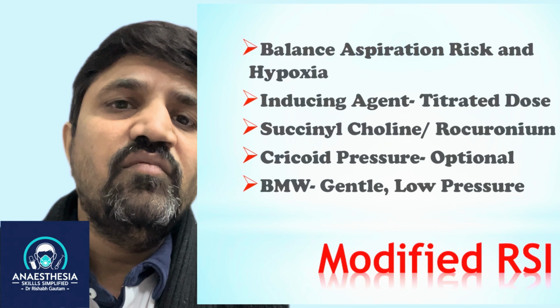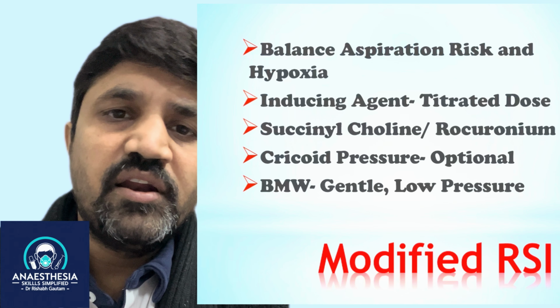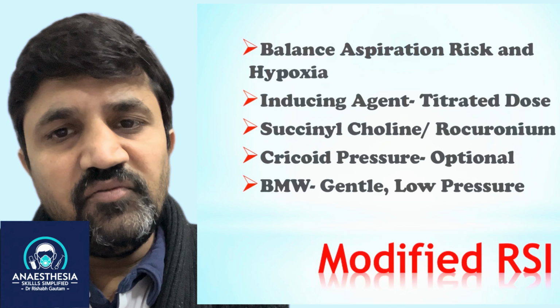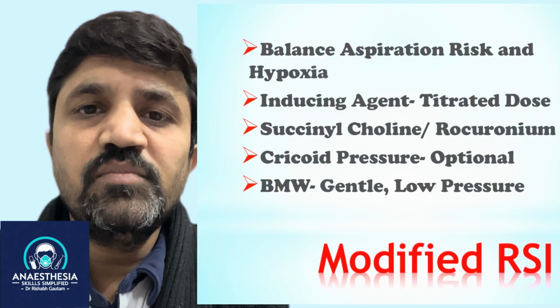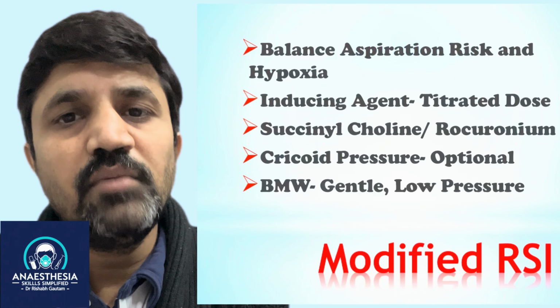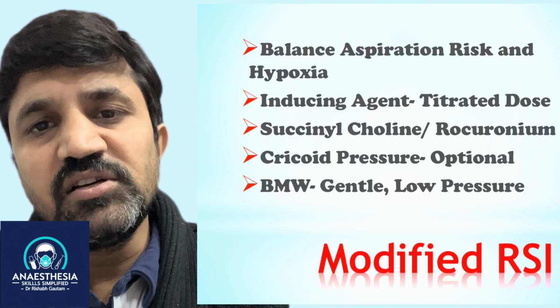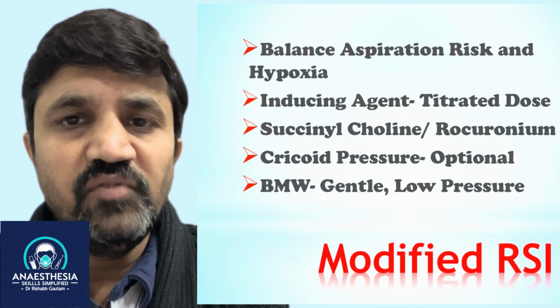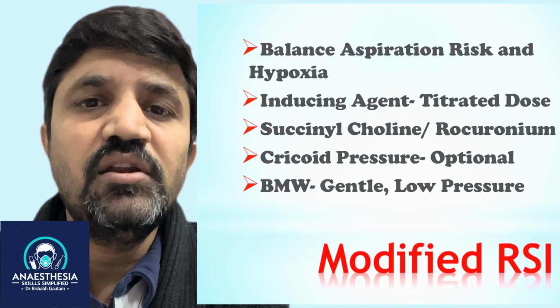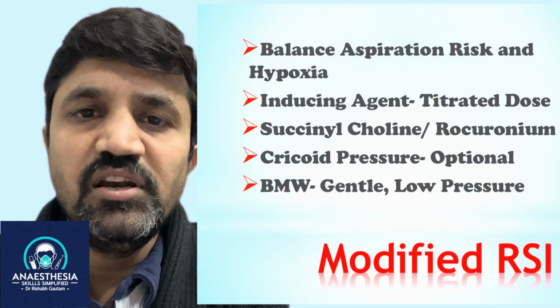Another modification was the cricoid pressure. The cricoid pressure, according to modified RSI, is optional, because if you go with the cricoid pressure, sometimes you may face difficult laryngoscopy and the greater risk is not being able to intubate. So in modified RSI, the cricoid pressure became optional. Whenever you feel that you are facing difficult laryngoscopy, immediately release the cricoid pressure. But in classic RSI, cricoid pressure is never released before intubation.